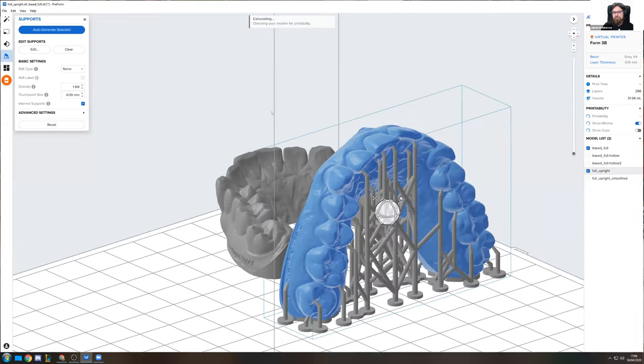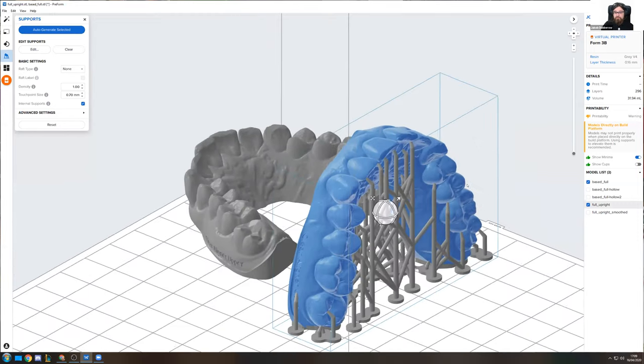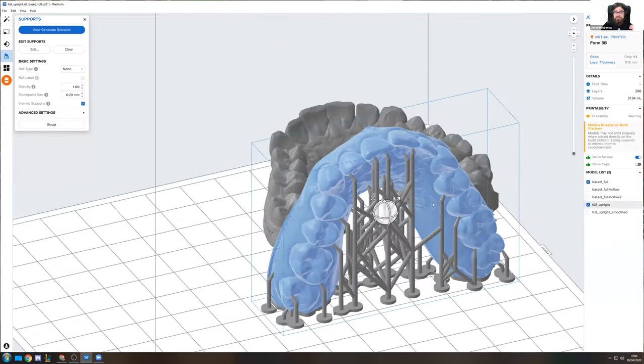I can actually have supports just be generated where we actually need them and not have the whole model be on top of supports. This will basically cut down on your printing time, and it will also cut down on resin consumption. But as you can see, this is actually quite a lot of supports, and there are supports that are in places where I generally would not want to have them.